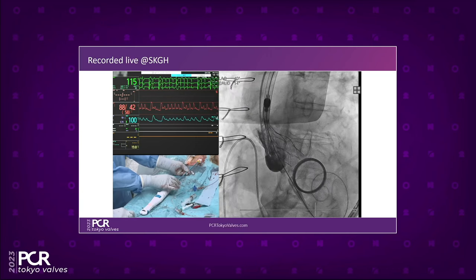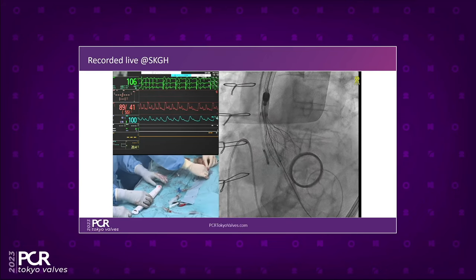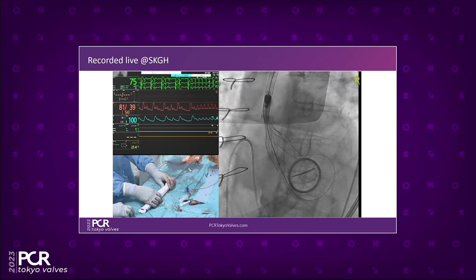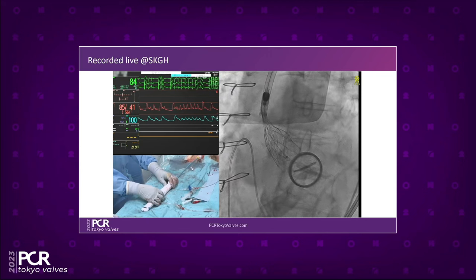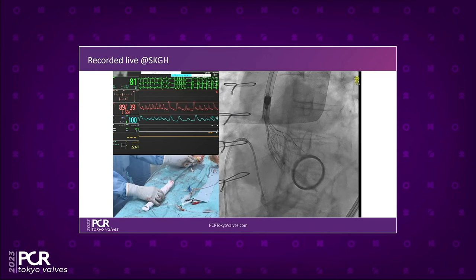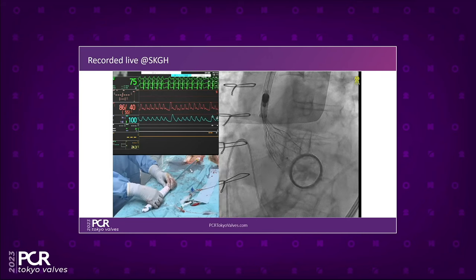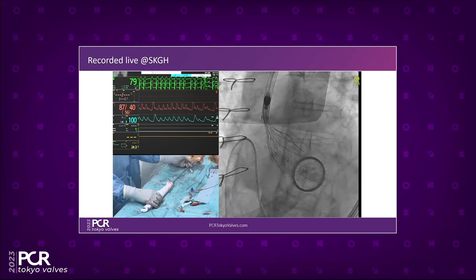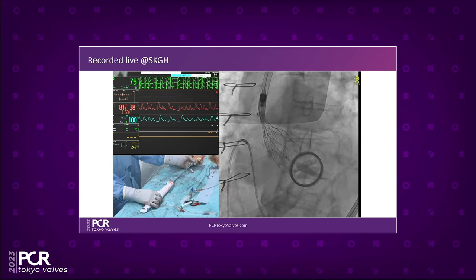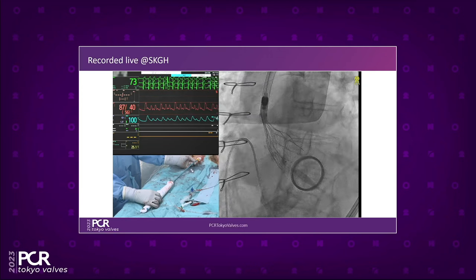As you can see, there's no interference between the mechanical mitral valve and the Navitor. So we decided to put the Navitor valve in this position because we don't have any interference and also there's no conduction disturbance. Our PVL is quite minimal. But you had the option if you want to recapture and reposition. This looked to me like a very nice position, high position, and no interference with the prosthesis.